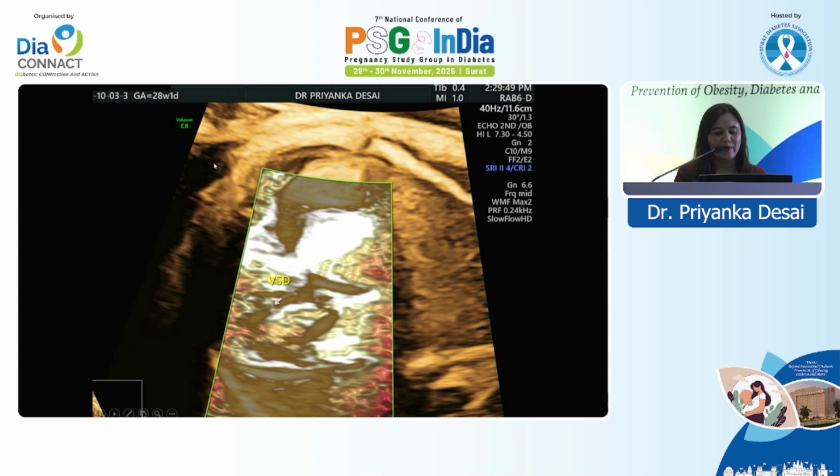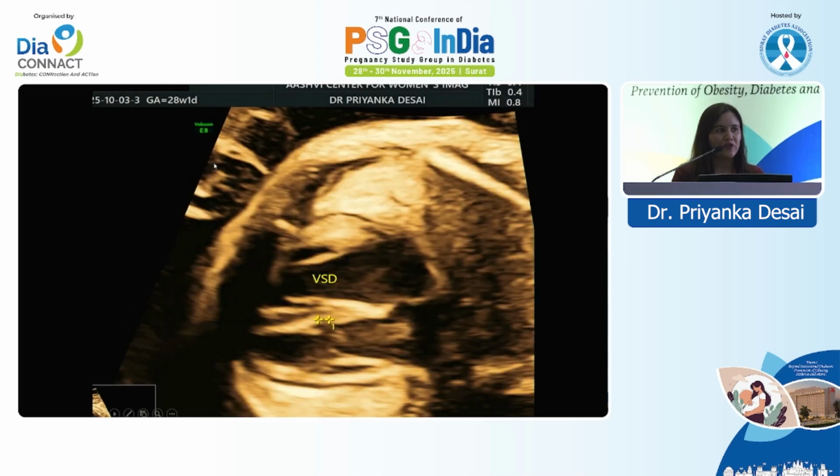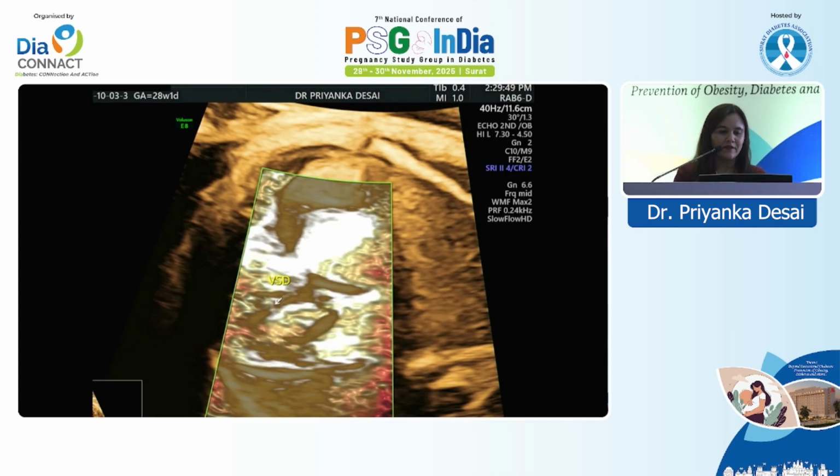Now next is a 28-weeker, and she is a known case of GDM. And this is a 4-chamber view of the heart. Again, small muscular VSDs are very commonly seen in fetuses of GDM mothers. And this is the color Doppler image which is showing the VSD.